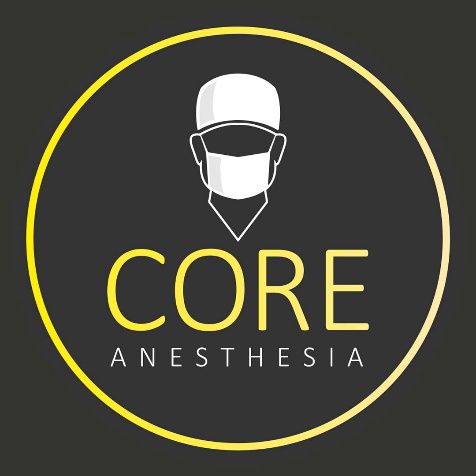Number 3, TEEs, or transesophageal echocardiography, where an even thicker probe containing an ultrasound piezoelectric system is passed into the esophagus to a position just posterior to the heart for obtaining high-resolution ultrasound images of the beating heart. Number 4, bronchoscopies, where the endoscope is inserted into the tracheobronchial tree. And number 5, fiber optic tracheal intubations for patients with difficult airways who require tracheal intubation.